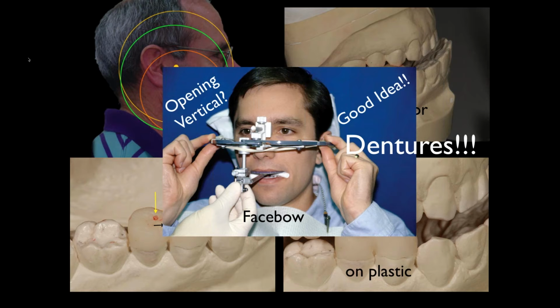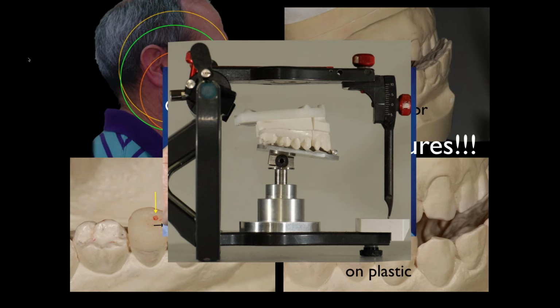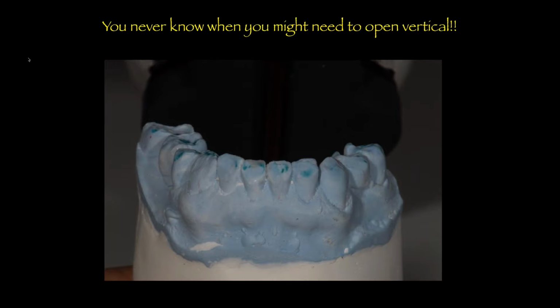All right. So, you know, we can get into basically the right zone using the mounting platform. But in many cases, a face bow is good or better. But here, you never know when you're opening vertical.